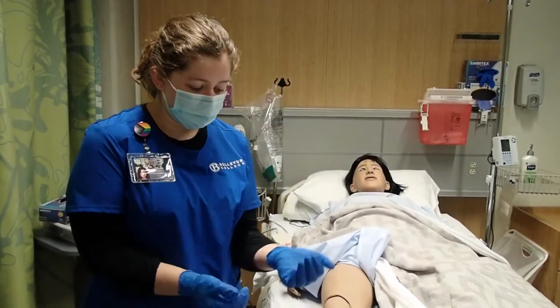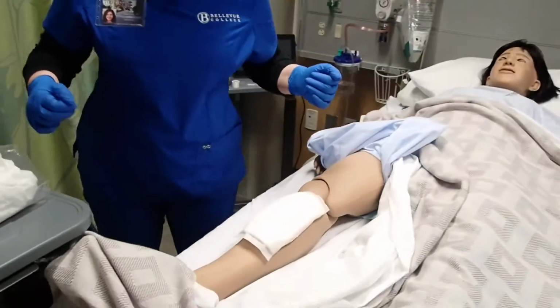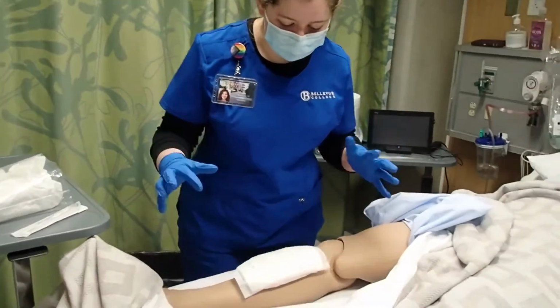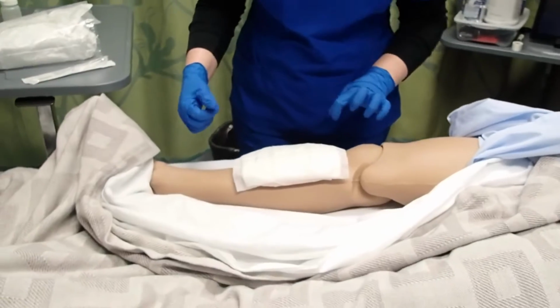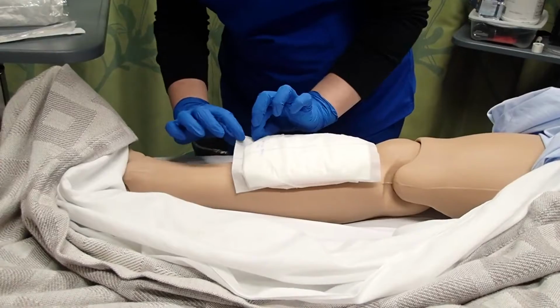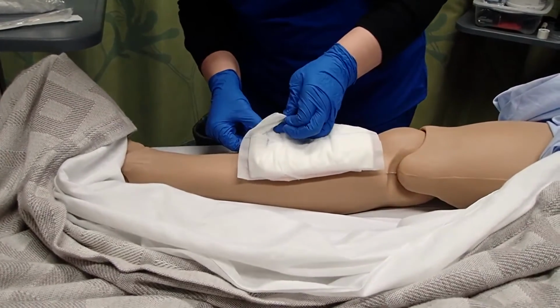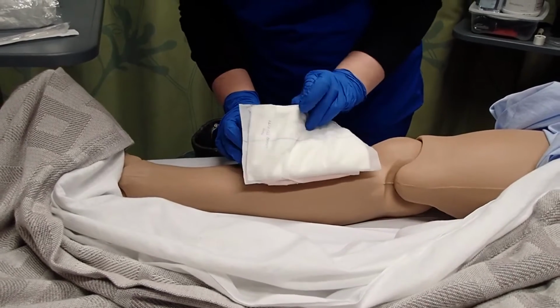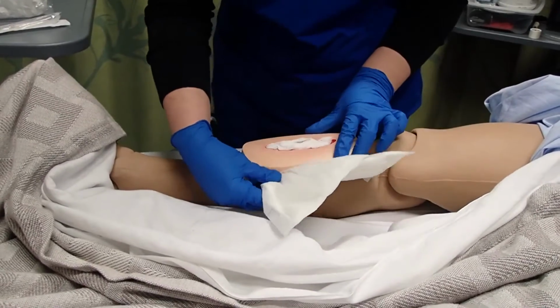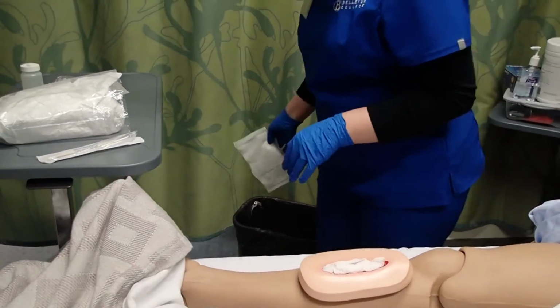Now that I have my clean gloves on, just gonna take the covers away. Now what I'm gonna do is uncover the wound and remove the old dressing. So I'm just gonna gently peel back the tape. Use an adhesive remover if I need to. Okay. Gonna discard the old abdominal pad.